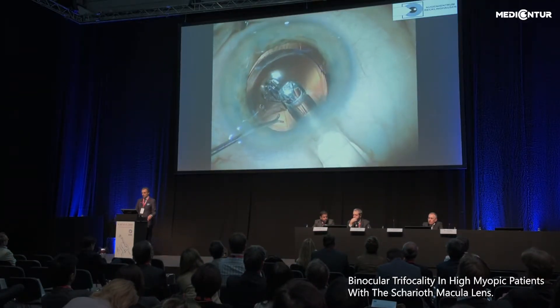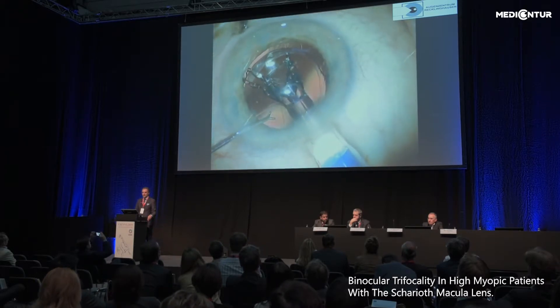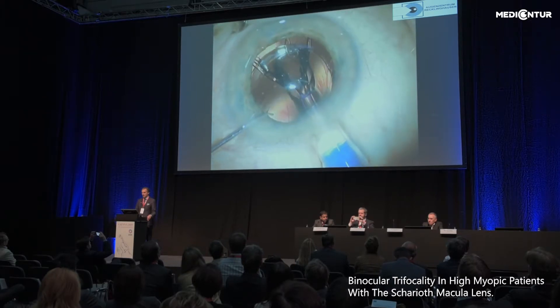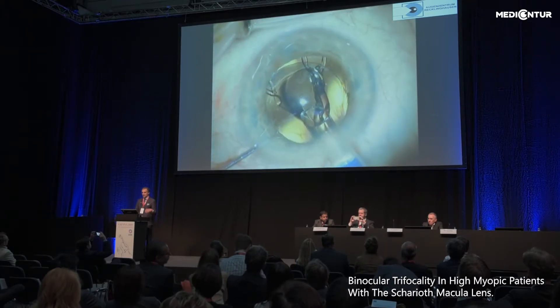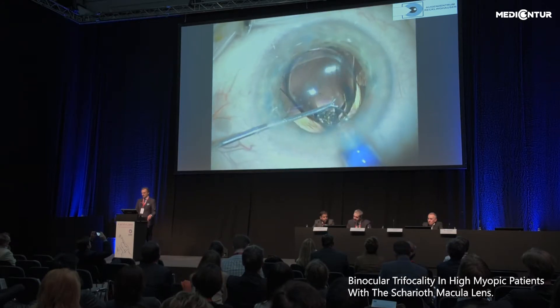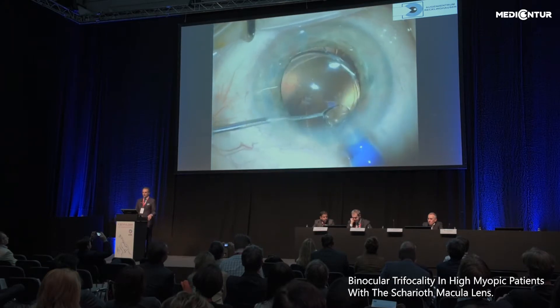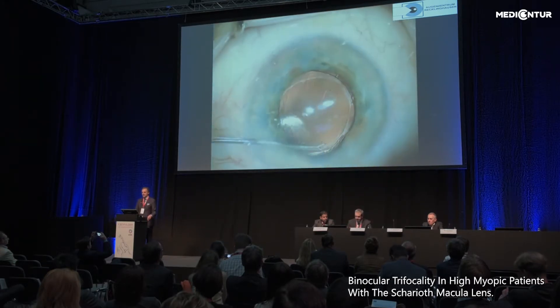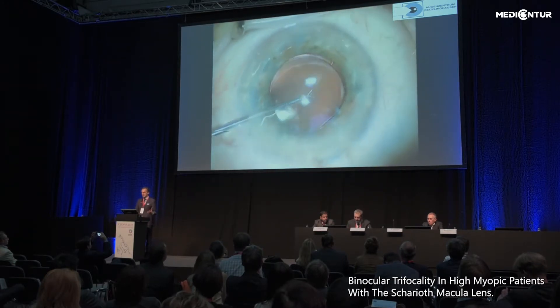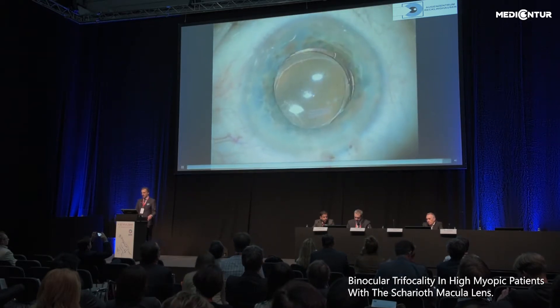Here I would like to share a video of the implantation. I personally prefer a slightly larger incision size and to have the nozzle of the cartridge inside the anterior chamber. I always use a second instrument to guide the haptics, and if everything goes perfectly, all the haptics are inside the ciliary sulcus. If not, you can use the second instrument to place them. You can see how nicely and immediately this lens centers.